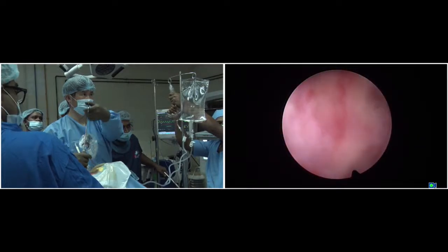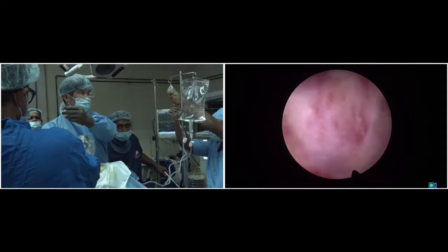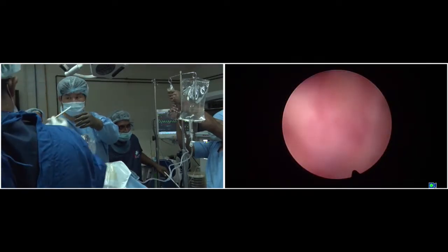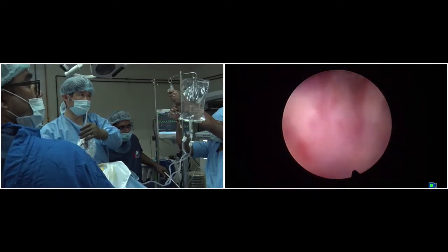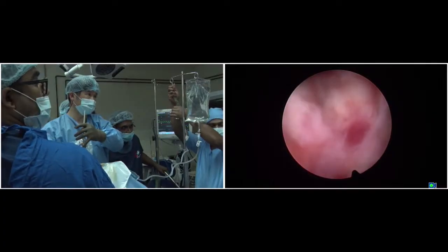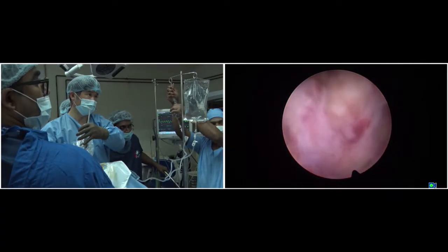Okay, finish, just finish. Great. Hook. Today, all the instruments are not adjusted for me because the operation is not easy. Today, I will finish. You can see the last fragment coming out.